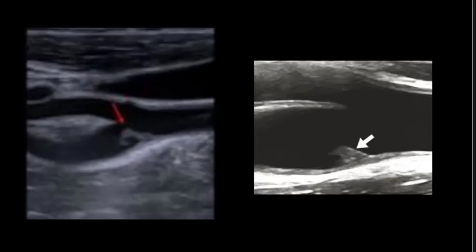Bismillahirrahmanirrahim. Assalamu alaikum warahmatullah. Today we have seen a very interesting case of an old lady who came for carotid doppler. We have seen a very rare finding of small webs in carotid bulbs on both sides. So we are discussing a few more things about carotid web.